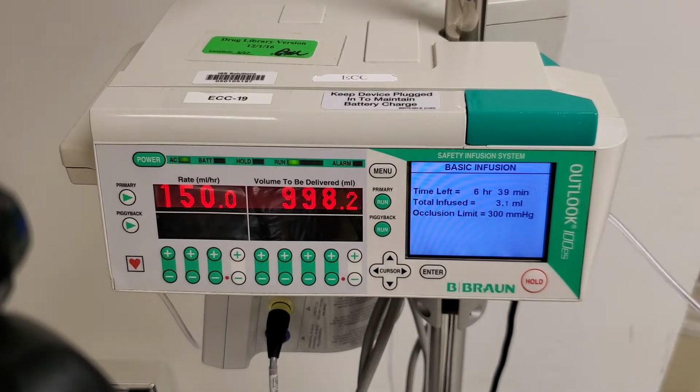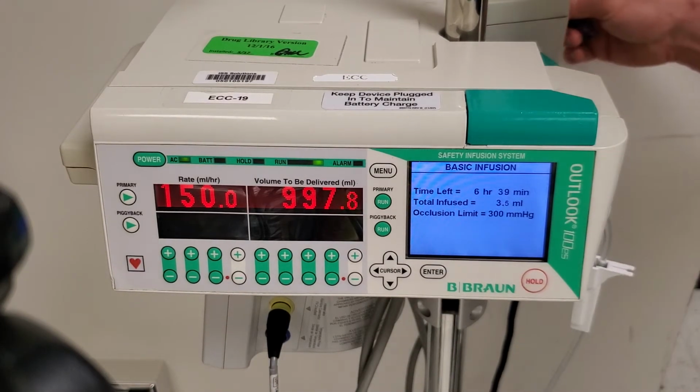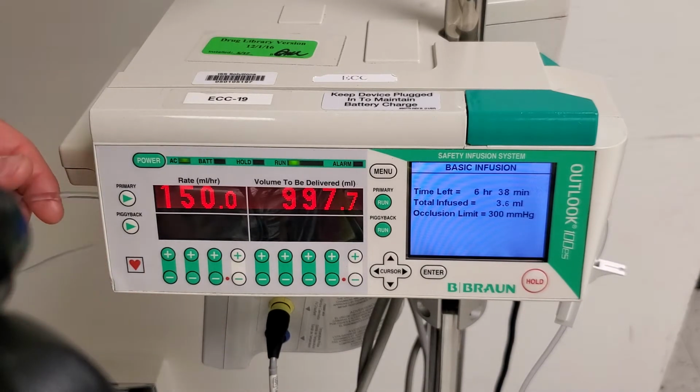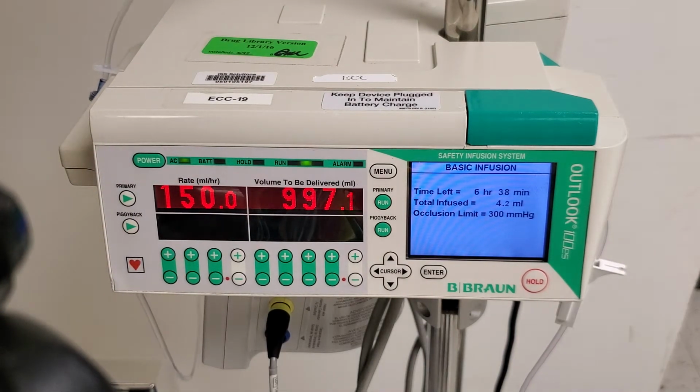The last thing we need to talk about with this pump are the alarms. There are basically 2 kinds of alarms. One alarm occurs when there's a problem upstream from the pump. So we'll clamp the upstream clamp. This alarm will go off if you run out of fluid, or if you get air in the line, or if your clamp is still on, or you've run over the tubing with the wheel of the stretcher. Any number of reasons. Anytime an alarm goes off, you'll get the audible alarm, and then the main screen will give you options to troubleshoot with.